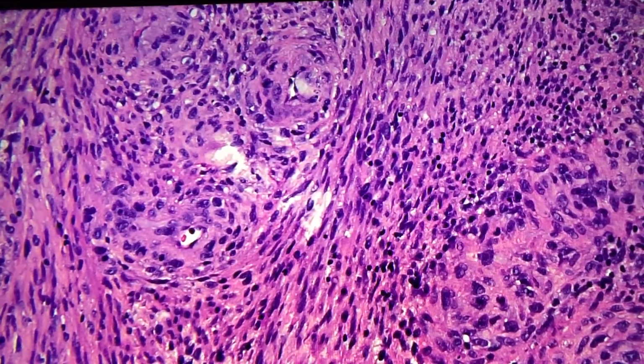These most often occur de novo like this, but the gliosarcoma areas can occur in a glioblastoma that's been irradiated previously. So this could be a recurrence of a glioblastoma after irradiation. And these are IDH negative, so IDH wild type tumors. Okay. All right. Next case.